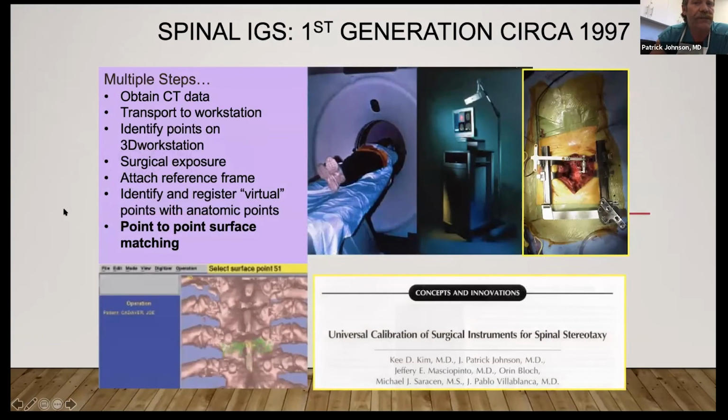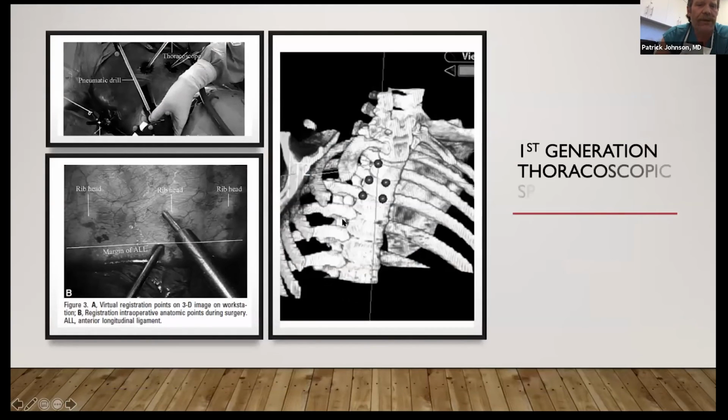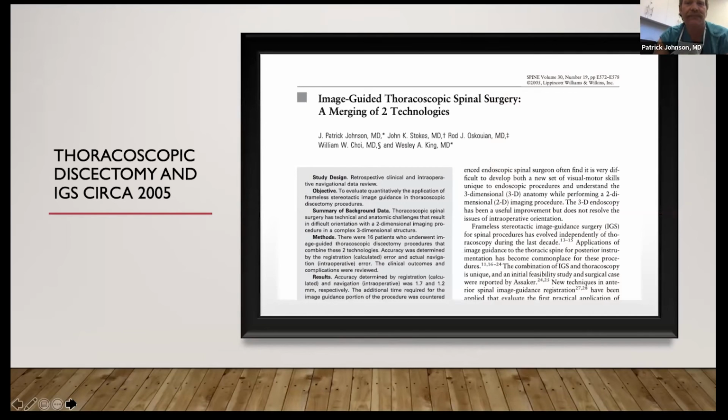And the first generation of these procedures, we used navigation in some of the early days, but the first days we didn't use any navigation. We would open the patient up, we would put endoscopic ports where we thought they should be. We did intraoperative x-rays, but when we started applying navigation and spinal stereotaxy, these were in the late 90s when we first started doing some of these procedures. And we did some research work of how to navigate off the front of the spine and use fiducials back before we had CT scanning and automatic registration. That's hence the black and white pictures.